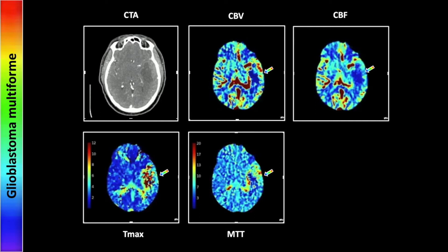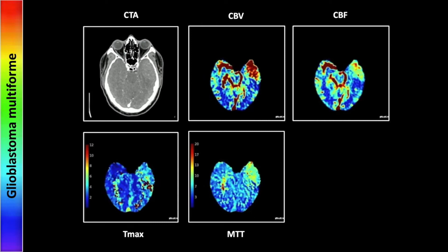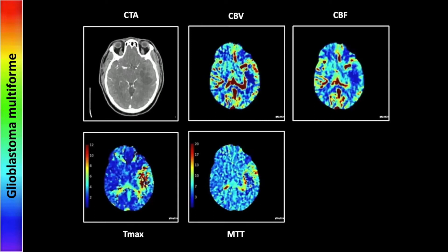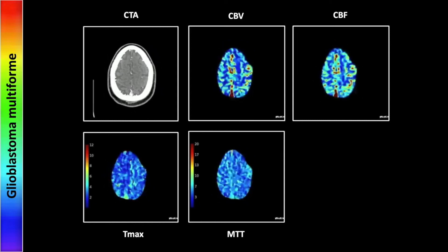Slightly higher up, as you can see on the CTA, there is actually a cystic or necrotic component as is typical with these tumors, and you can see that is showing up on the CBV and CBF with reduced perfusion. The Tmax and the MTT are of questionable value here, but they do show an abnormality in the region with an increase in the Tmax. In the videos, the CBV and CBF are increased in the solid region and decreased in the necrotic or cystic portion of the tumor.